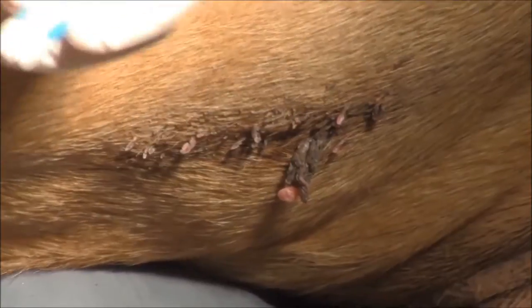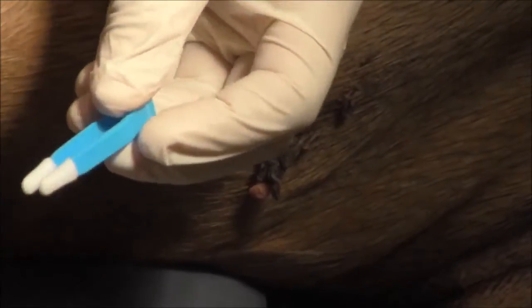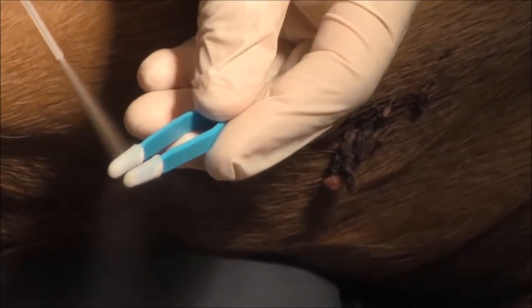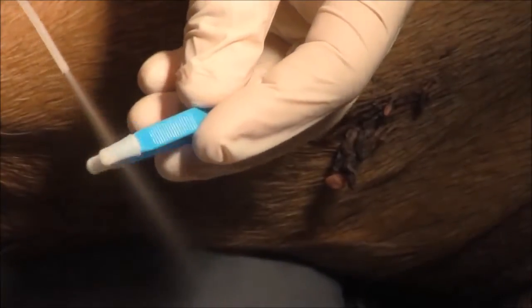What we're going to do is take the Cool Renewal and spray it on this little applicator — it's like some tweezers. Basically we're going to spray it and it's going to make these tips really cold. We're going to spray it good for this demonstration.